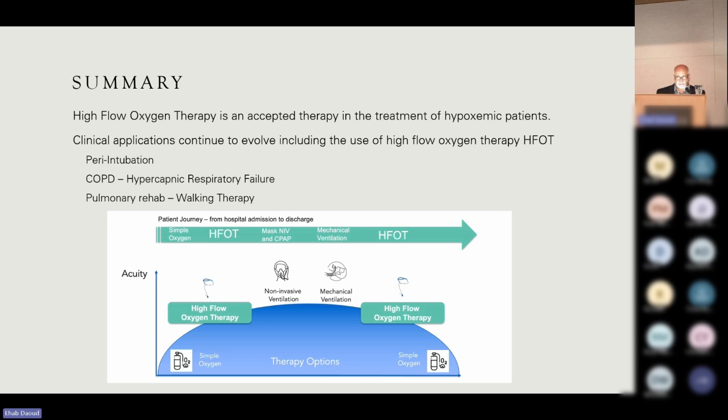So the question was about the use in pediatric and neonatal areas of cannulas with larger diameters and their ability to transmit pressures and trigger. And I would say that we tend to learn a lot from the neonatal and pediatric care of patients. And a lot of times we realize that we've gone off course. I think another area where we could go back and look at things is the basic, I know people will yell blasphemy, but the basic application of square wave. If we knew what the right effective lung volume was and the right dead space, then we could apply the appropriate tidal volume and not necessarily worry so much.